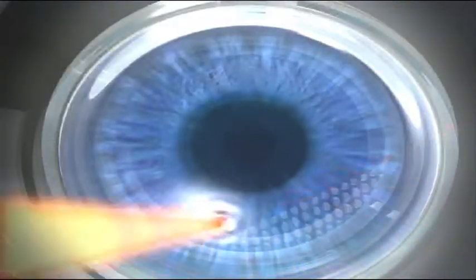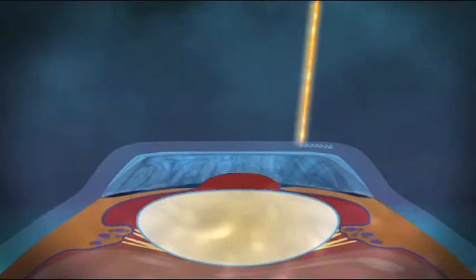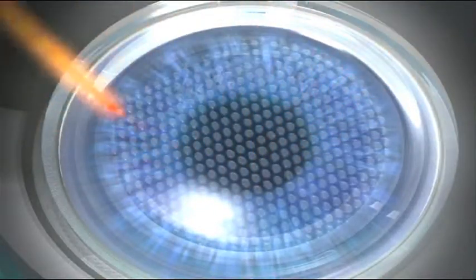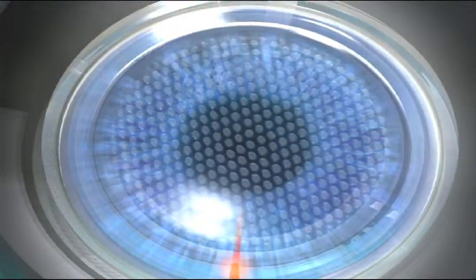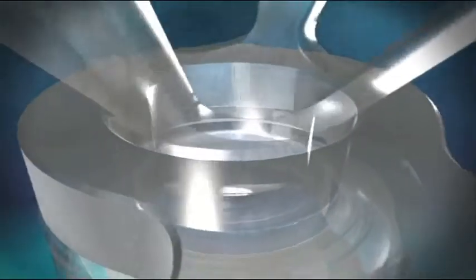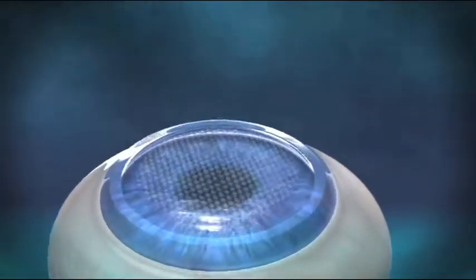The laser works by causing a reaction to happen, which results in a layer of bubbles at a very precise depth in the cornea. This layer of bubbles separates two layers of the cornea, forming that corneal flap.